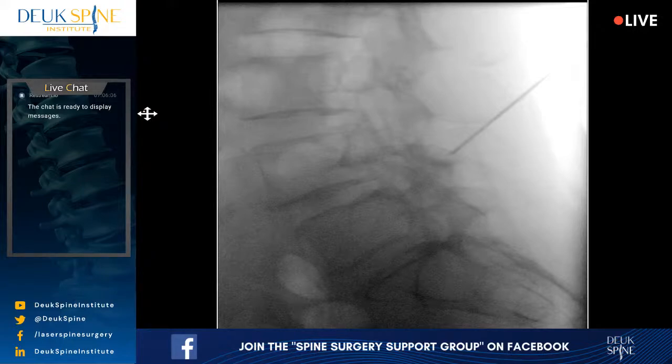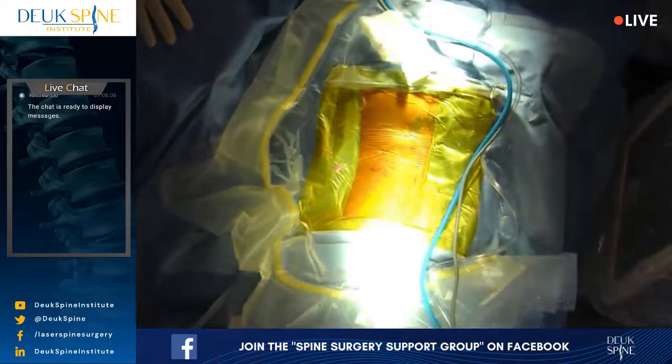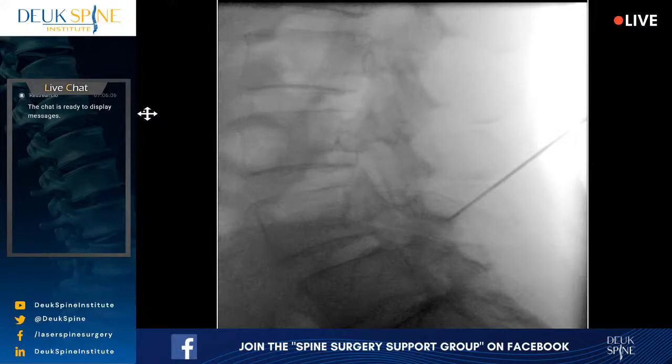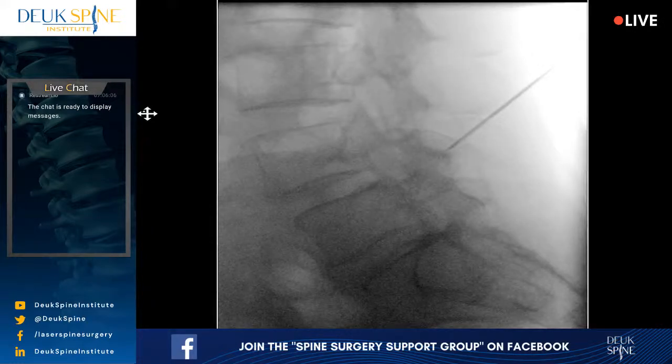Jordan, it's not too bad. Let's just play with the WAG a little bit. Let me release it for me and let me look at it. Shot. That looks worse. Shot. Shot. I'm looking at the pedicles of 5. Shot. Does that look better? Anybody agree with me on that? I still think we have an orbital issue. So why don't you bring the base south? Good. Release the WAG. Shot. Shot. Shot.